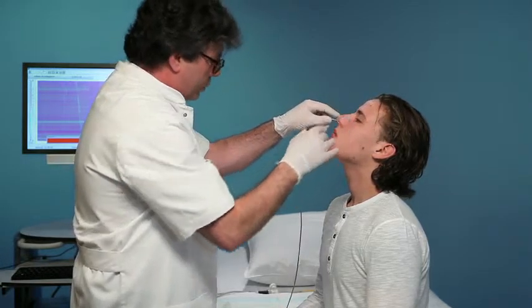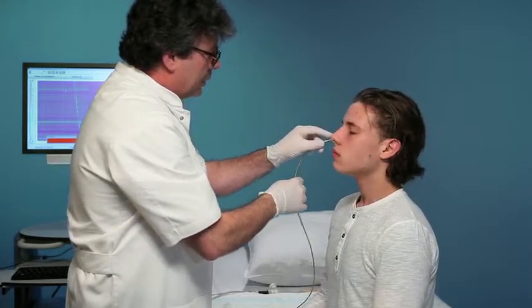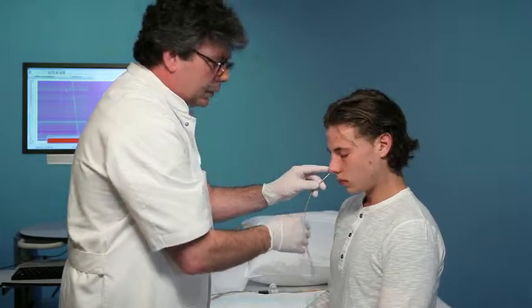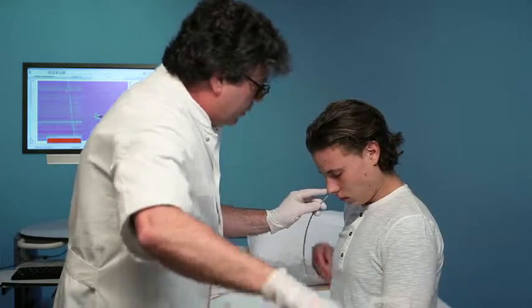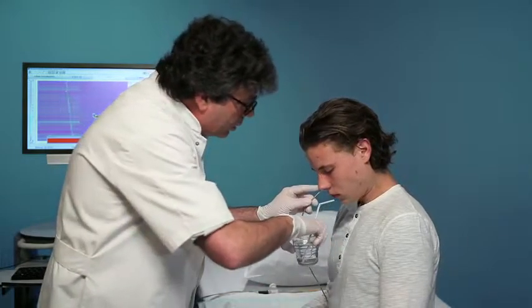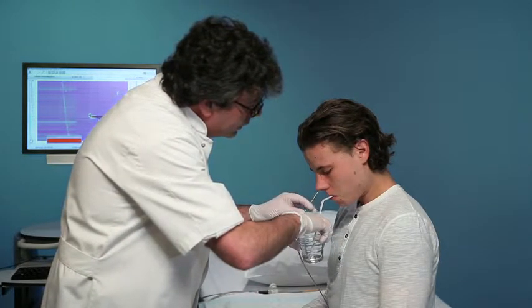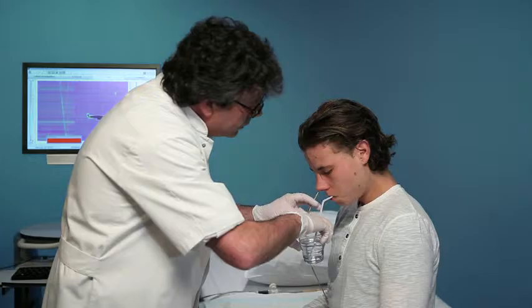Instruct the patient to bring his head forward to swallow the catheter. Let the patient take small sips of water. This will ease the process.